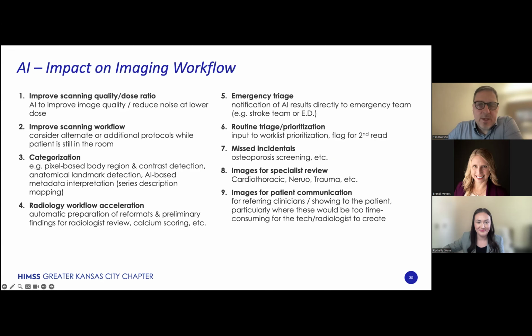So here's an example. As I said before, AI brings a lot more than just plain image analysis to the table. We can improve scanning and reduce dose, categorize studies automatically, accelerate workflows, triage, flag incidental findings, auto-route for specialist review for emergency and urgent cases, and then finally, improve patient communication.